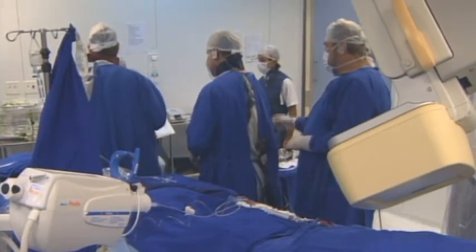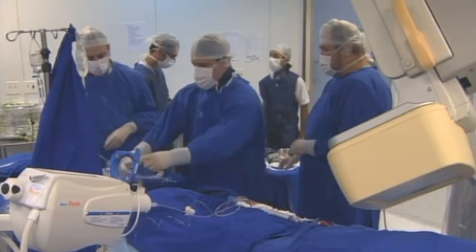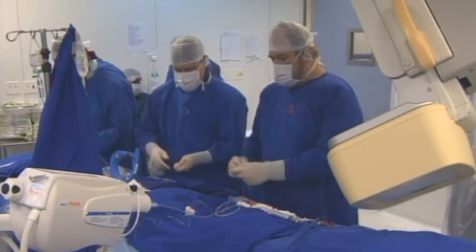The LAD is a TIMI 2 flow. Certainly, that's a very high-grade stenosis. It's going to come to the LAD, which is TIMI 2 flow. So I think it would have been prudent to start with the LAD anyway.